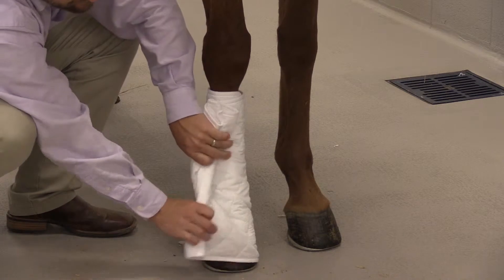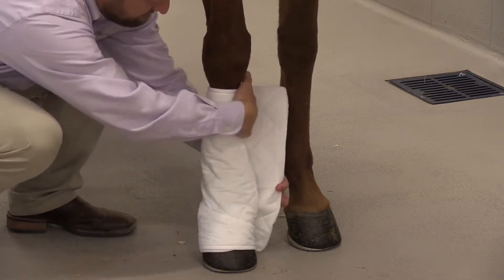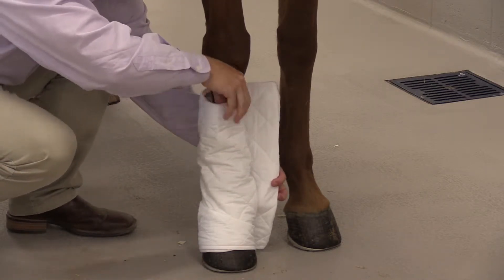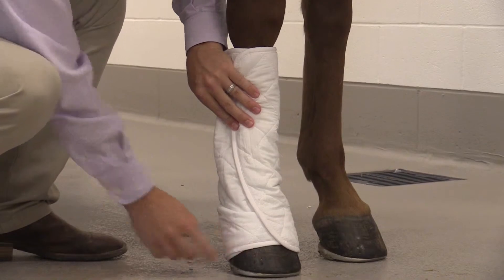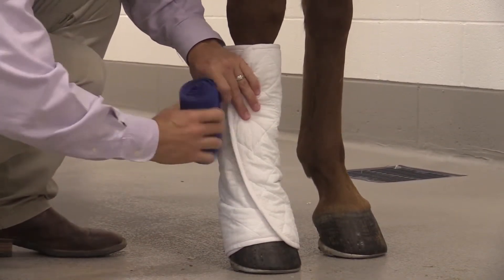The quilt will be placed again almost from the ground up and will mold to the contour of the leg. It does not really have to go on tight, but we try to prevent creases against the skin when applying this quilt as that protective layer.